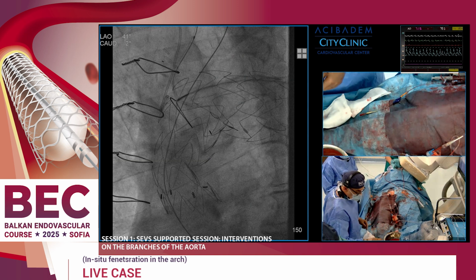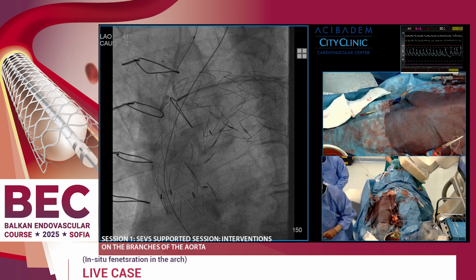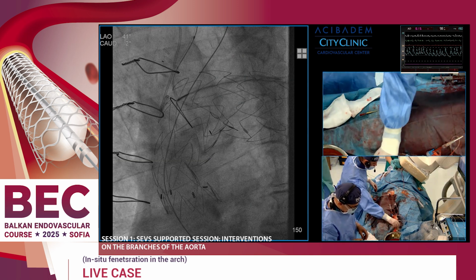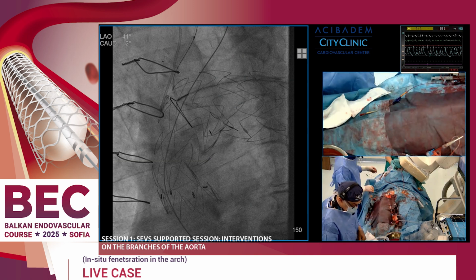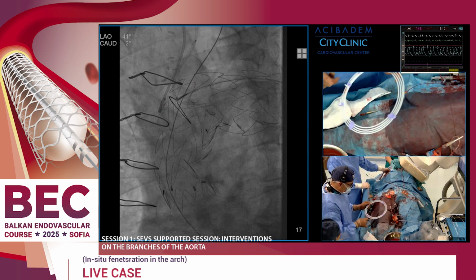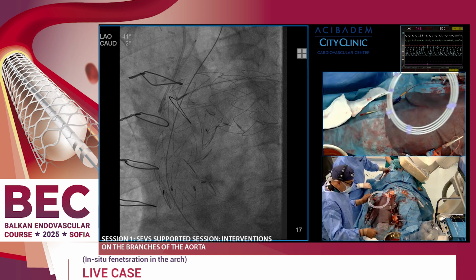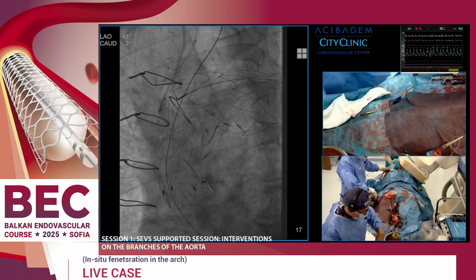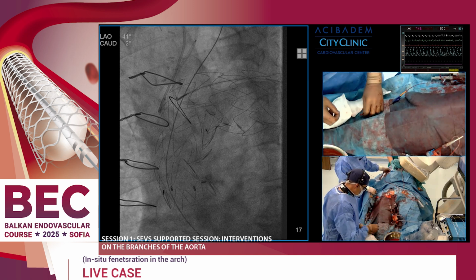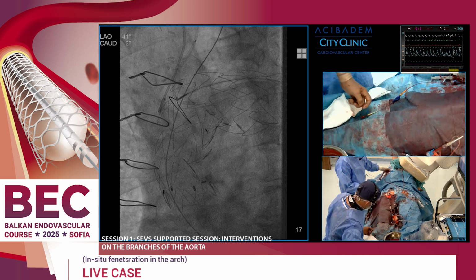We are going to change the wire because there is some damage of the tip, and the tip is the most important part. If you want, you can probably continue with the program, and of course we are going to record everything, and we'll let you know when we are ready to be online, to be live. Good. What do you think?